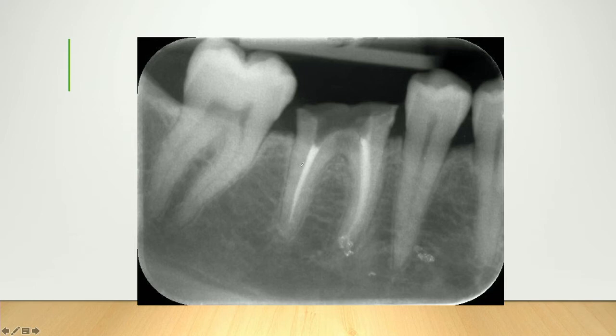If it's not root canal treated, then if you have a retained root like so, that's not a big deal because it's below the alveolar crest. If you had a retained root, for example here, that's not going to work. You're going to get an infection. So you definitely have to have it below the alveolar crest so that you've got, say, 2-3 millimeters of bone, and that will basically grow over.